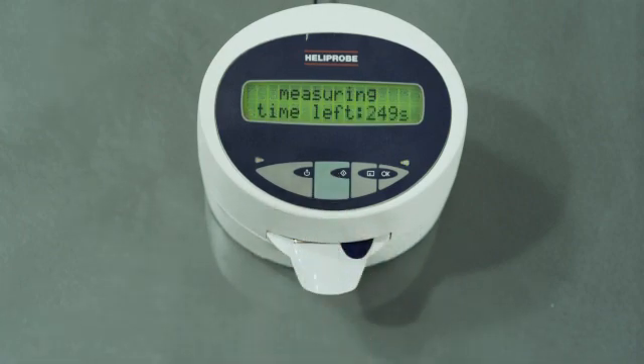Press the green button to begin the analysis and wait for the results. After approximately 4 minutes, the instrument will beep, indicating your results are ready. A test result value of 0 indicates that the patient is not infected with Helicobacter pylori. Refer to local procedure for further care.